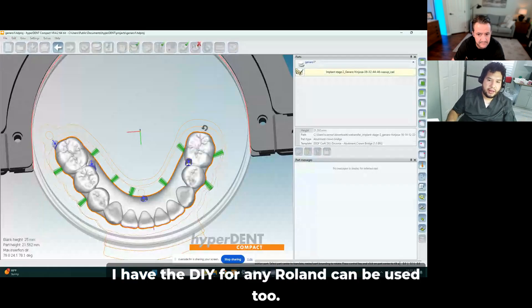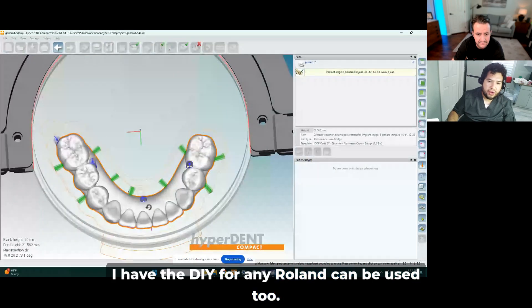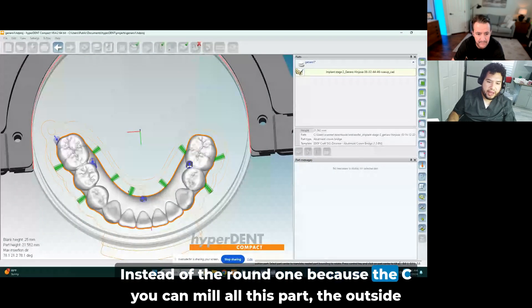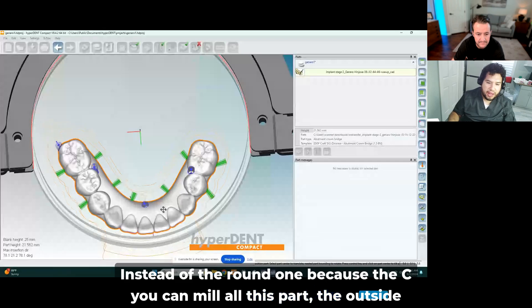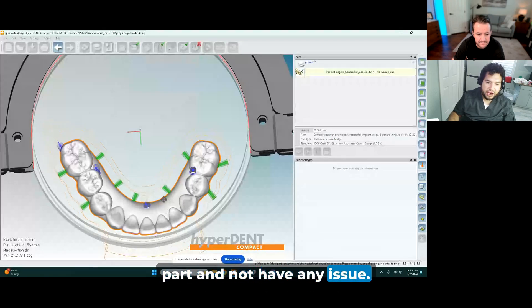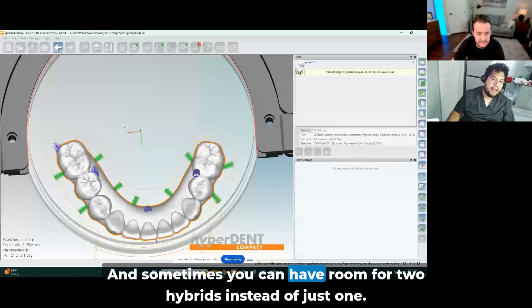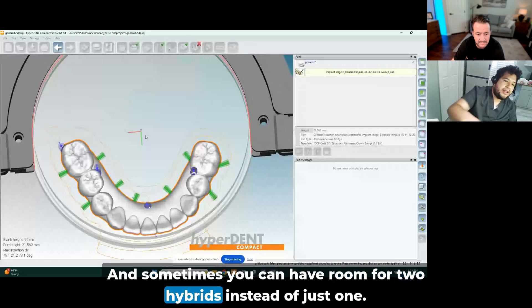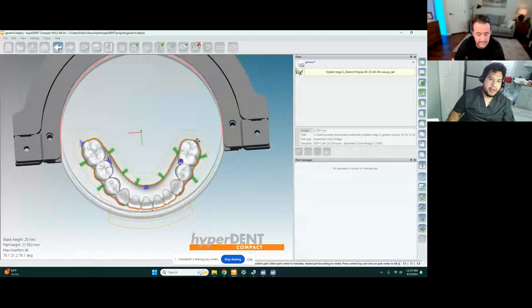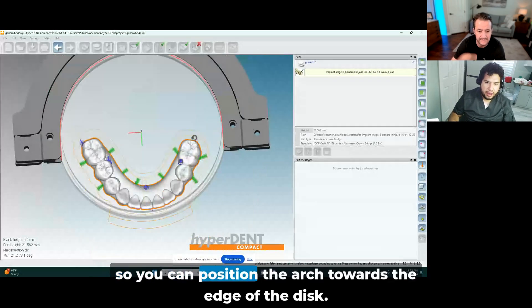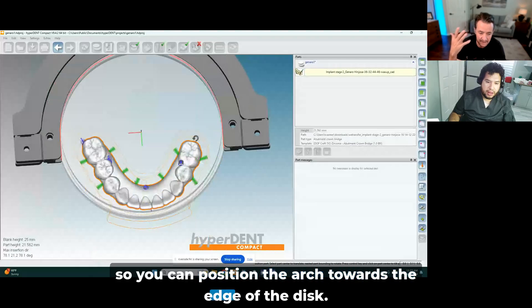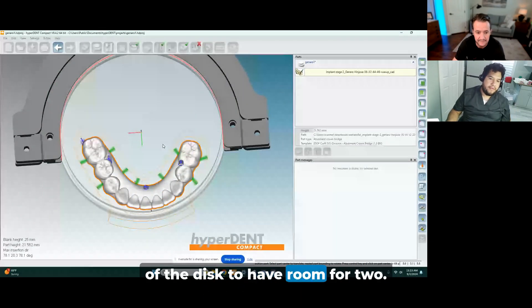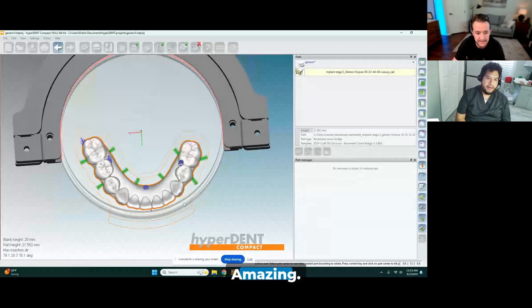Now I have everything in place. I like to use the C-clamp. I have the DOF or any Roland can be used too. Okay, instead of the round one, because the C you can mill all this part, the outside part, and not have an issue. And sometimes you can have room for two hybrids instead of just one. So you can position the arch towards the edge of the disc to have room for two. Amazing.